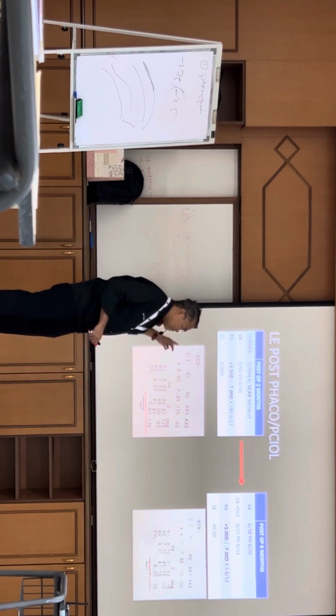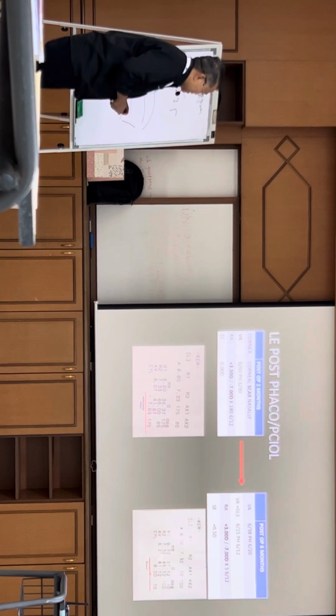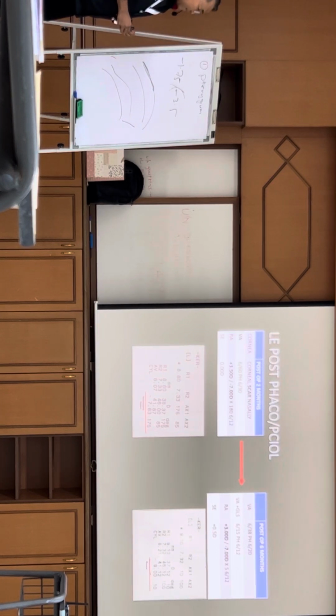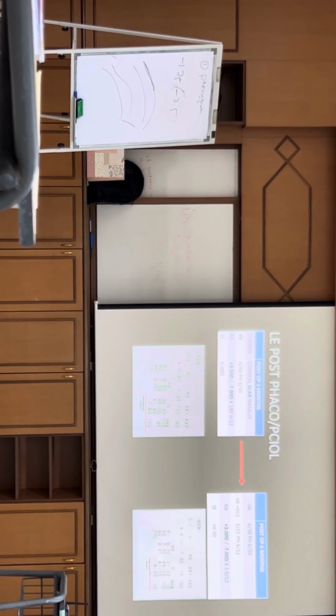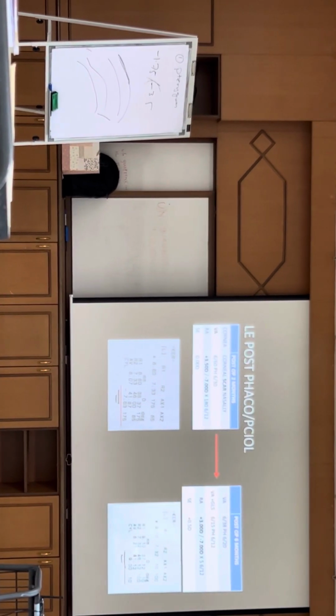Is this actually a temporal or a superior incision? Superior, so you can actually get the feeling that, let's say, there is 2.75. So unpredictable, like the cornea. Yes, that's correct. But this contribution is all from the steep cornea. It might be. If you do a temporal incision, it may be.